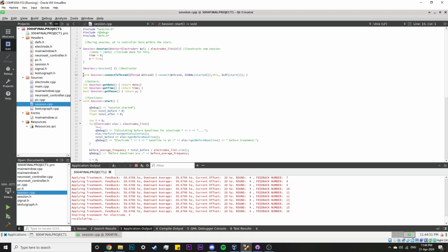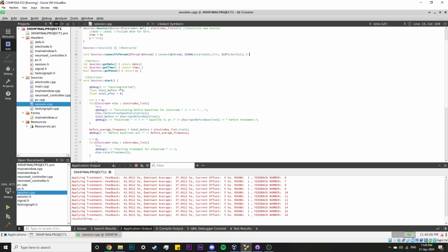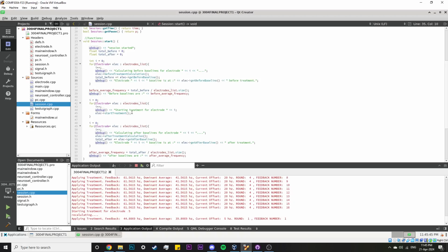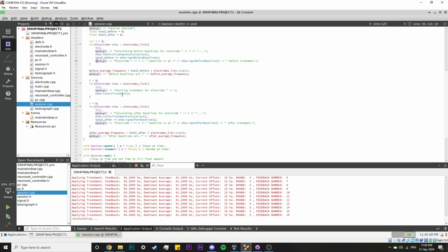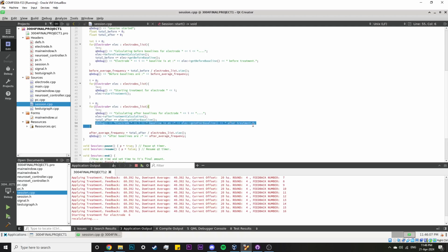As you can see, the connect to thread function connects the start of the thread to the start function in session. In the start function in session, you can see it starts the session and then it iterates. In the first for loop, it iterates through all the electrodes and calculates the before treatment calculation, gets the before baseline frequency and adds it to the total, and then it averages it out and prints that out afterwards. Then it iterates through all the electrodes again in another for loop. It starts the treatment on all the electrodes. And then in the third for loop, it iterates through all the electrodes and starts the baseline calculation for after the treatment and adds that to the total for after, and then it averages those out and prints those out.